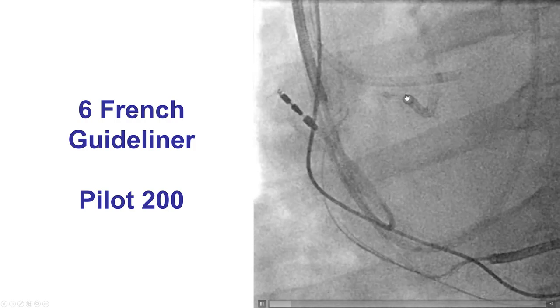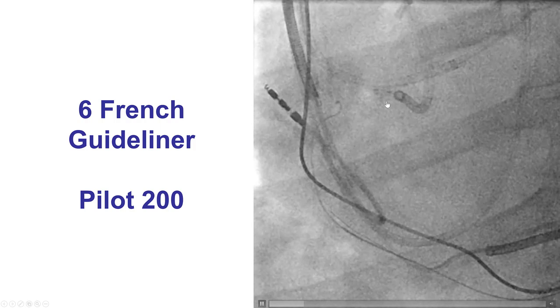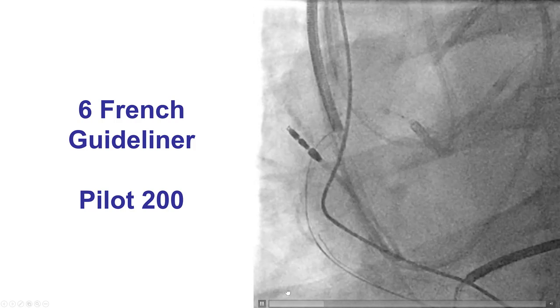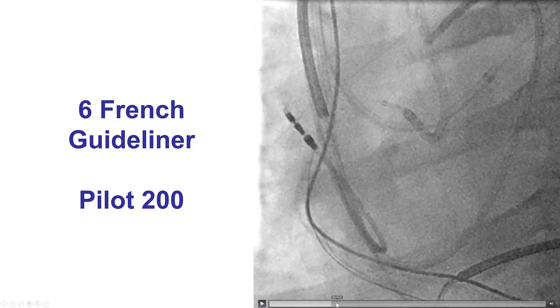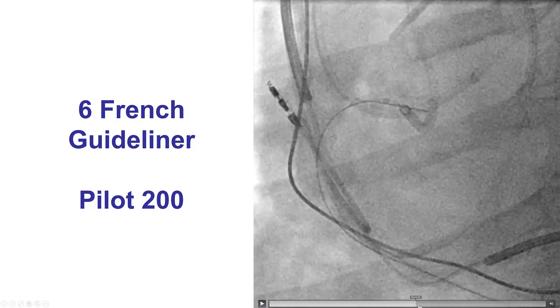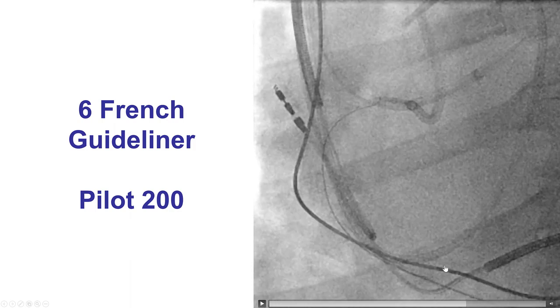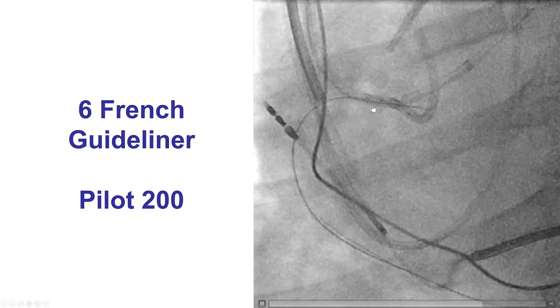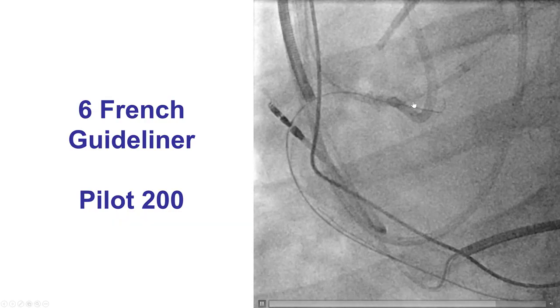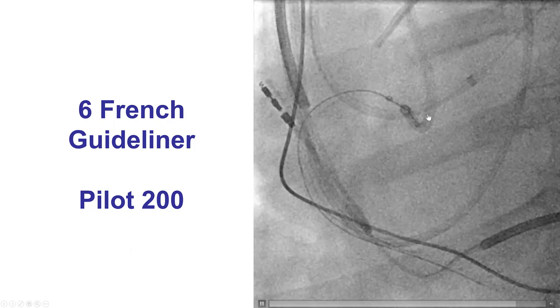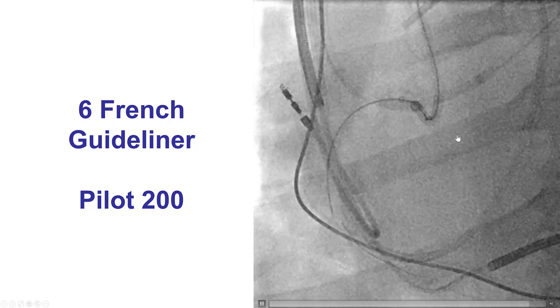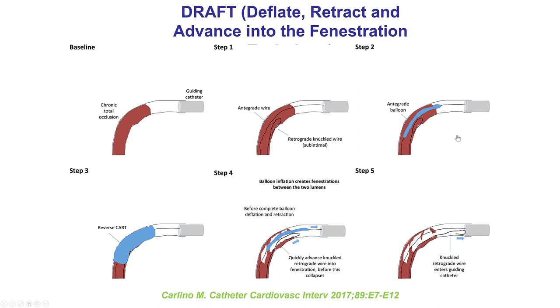In our case, a 6 French guide liner was inserted into the proximal right coronary artery, and a Pilot 200 guide wire was advanced. After inflating the balloon in the proximal right coronary, deflating, and pulling it back into the guide extension, the guide wire eventually popped into the antegrade guide catheter extension. This illustrates the so-called DRAFT technique — Deflate, Retract, and Advance into the Fenestration.